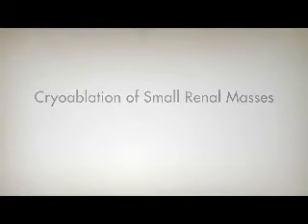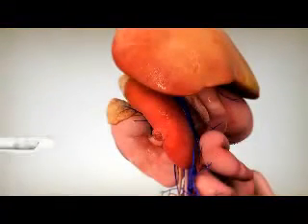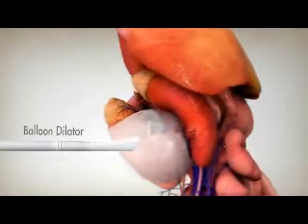Cryoablation is a minimally invasive treatment for kidney cancer. In the retroperitoneal approach, the patient lies on his or her side and small incisions are made toward the back of the body. A balloon dilator is initially inserted to move the kidney away from the back.